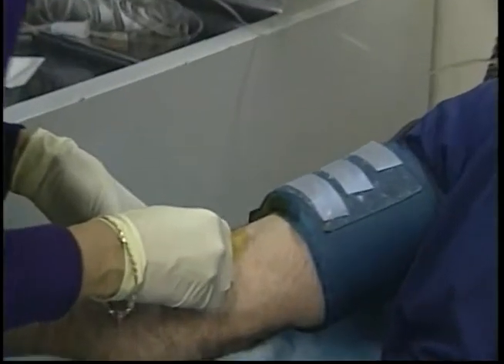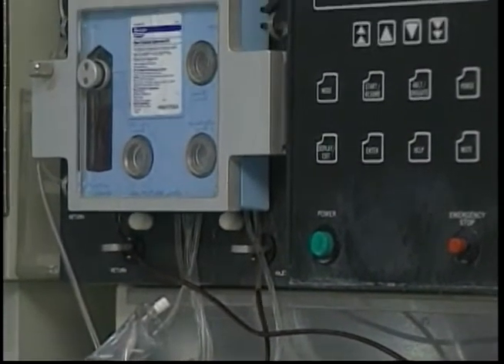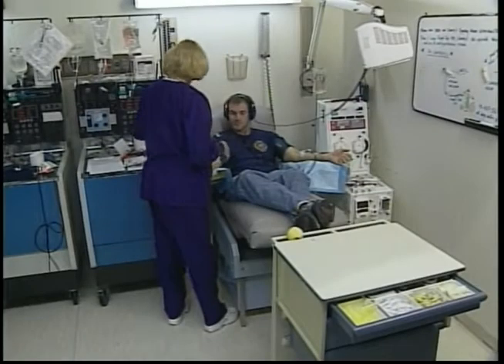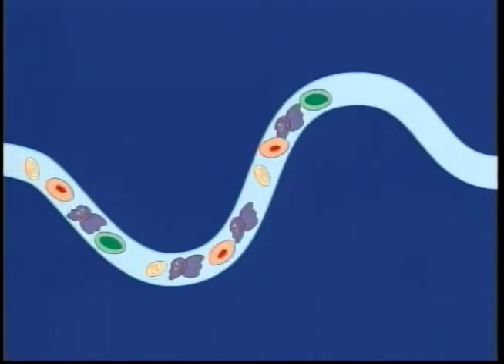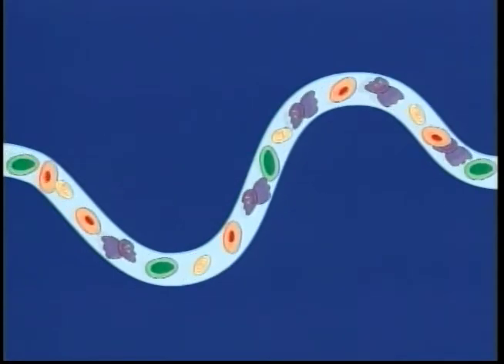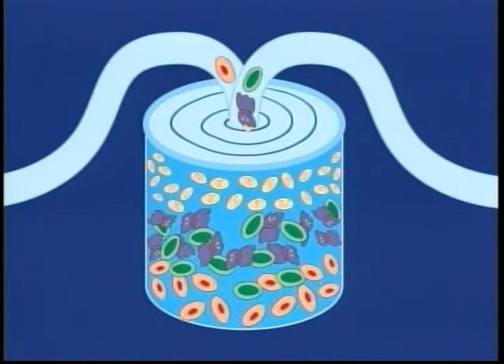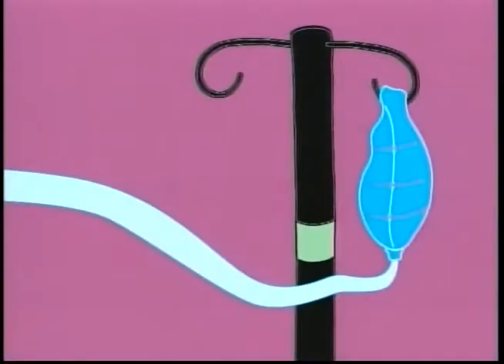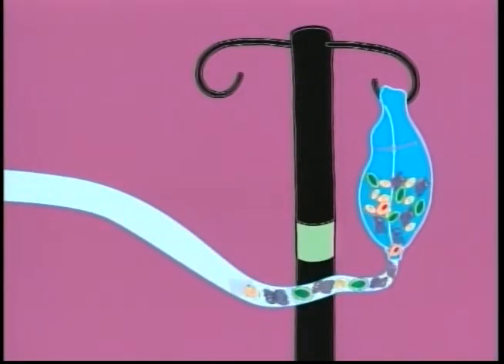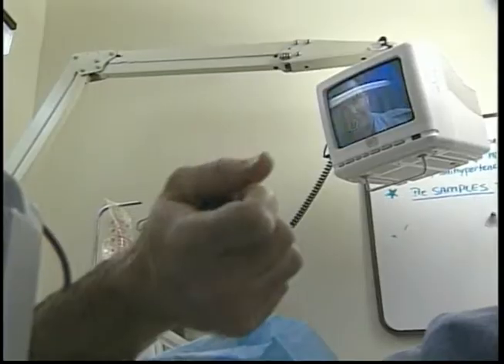A daily dose of growth factor is given for a period of several days. Then, the patient or donor will spend several hours connected to an apheresis machine. During apheresis, whole blood is pumped from the vein, components are collected, and the rest of the blood is pumped back into the patient. For this procedure, the white blood cells, including stem cells, are separated for later processing. The process is no more painful than an IV. However, it has been found by some patients and donors to be somewhat tedious.